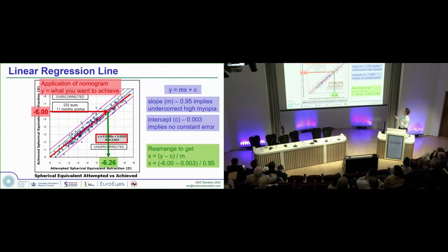And so if you do the maths, you've got to rearrange the equation, but you'll find that, once you've rearranged the equation, that's the formula that you want to put into your spreadsheet, and then you can use that moving forward for your future treatments.